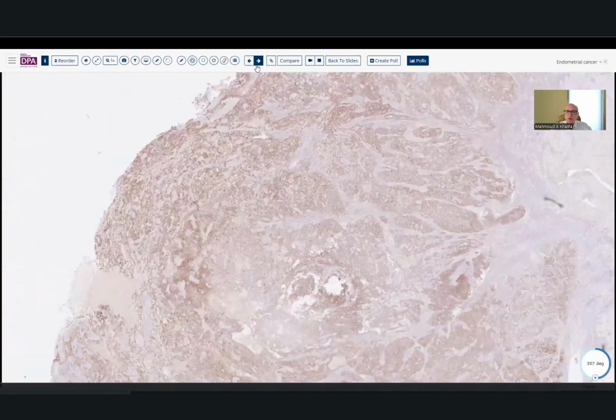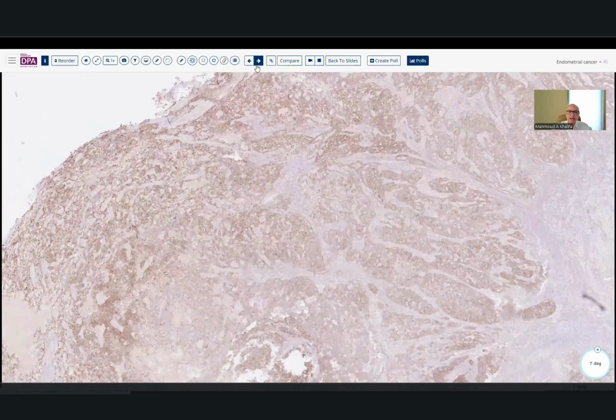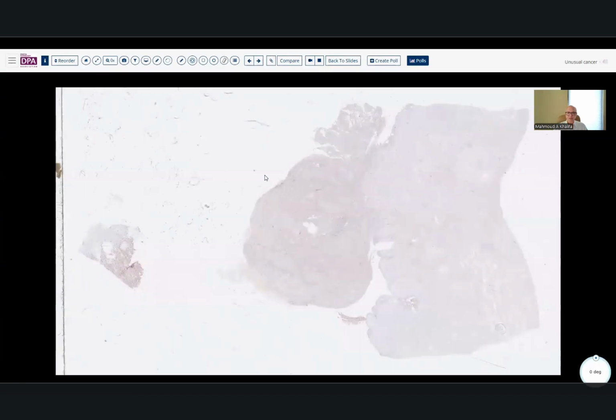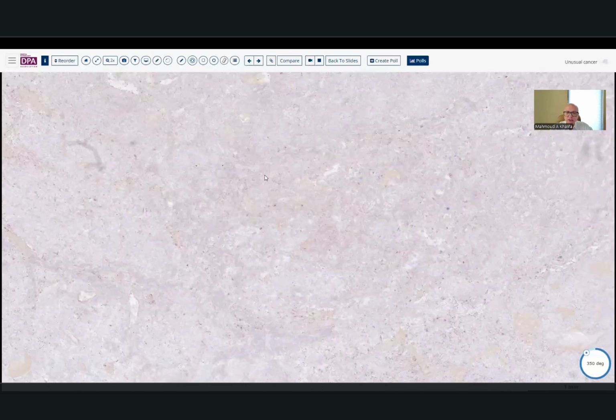With serous carcinoma, once we call it serous carcinoma, once we call it P53 abnormal, we have to do HER2, because this was called HER2 equivocal, 2 plus. So these patients will receive Herceptin, will receive anti-HER2 treatment. I tried NAPSIN-A to show the clear cell differentiation.